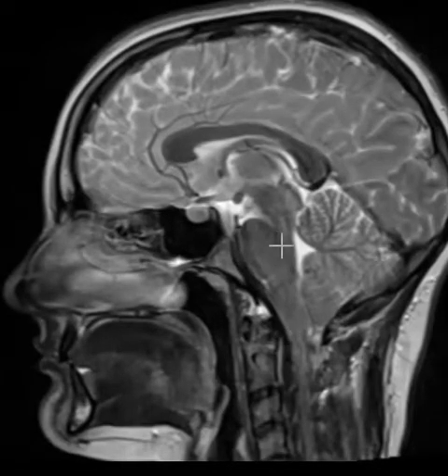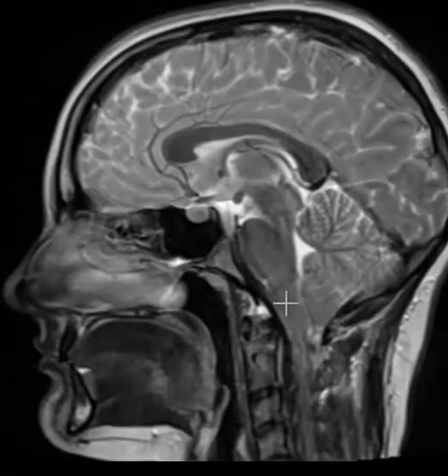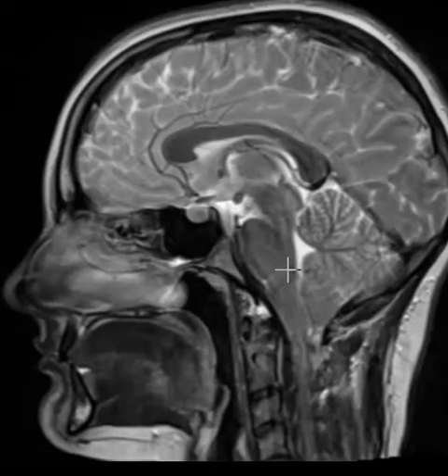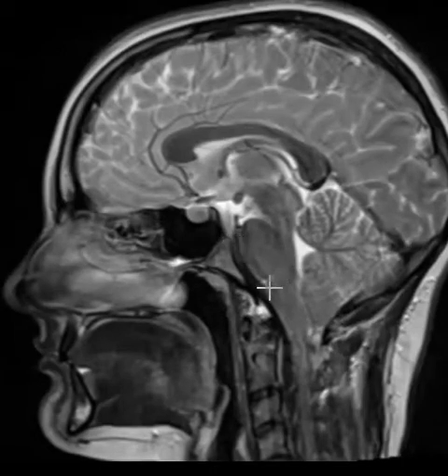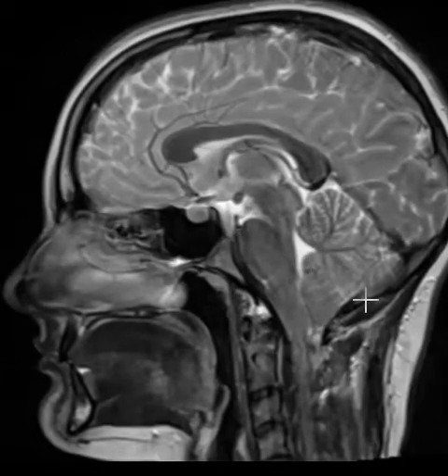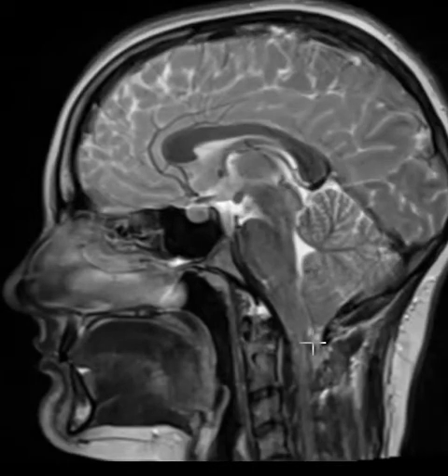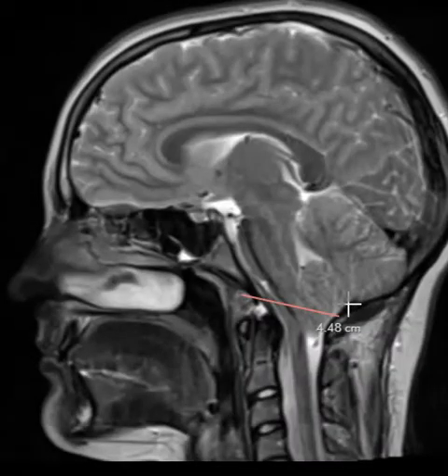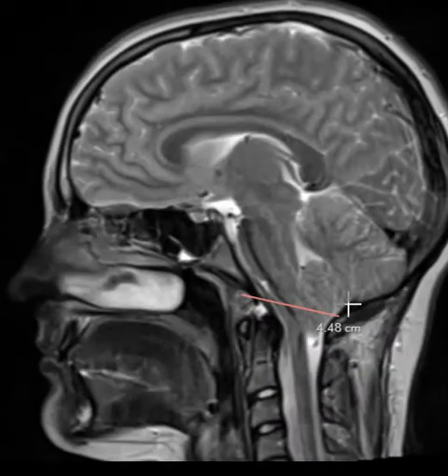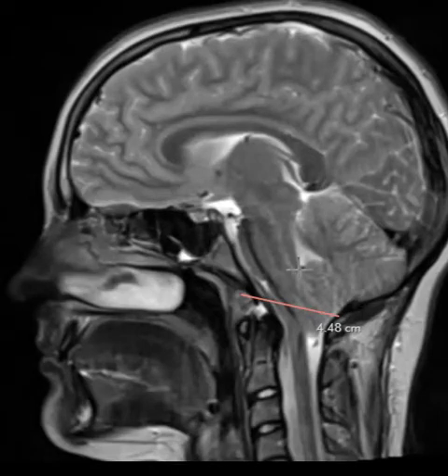This is the brain stem. This is the pons, looks like an egg, the medulla, and these are pushed forwards and flattened a little bit because the cerebellum is abnormal in position, pushing forward and going downward. So this is what we call a Chiari malformation that we just found incidentally.